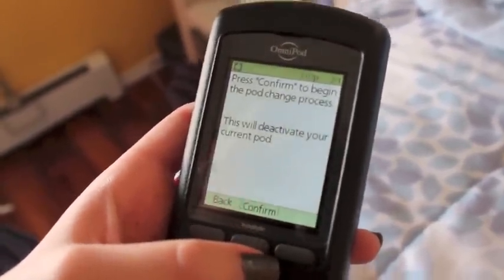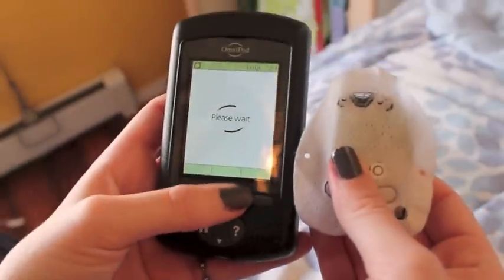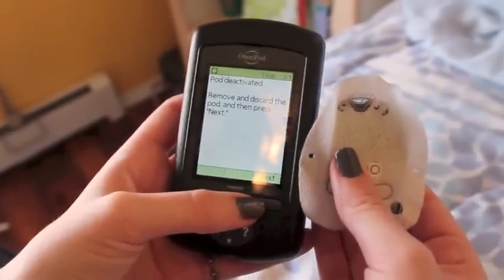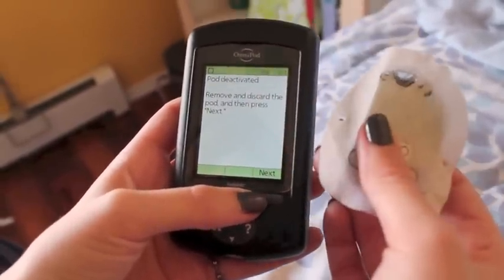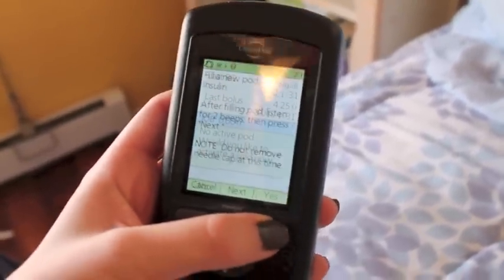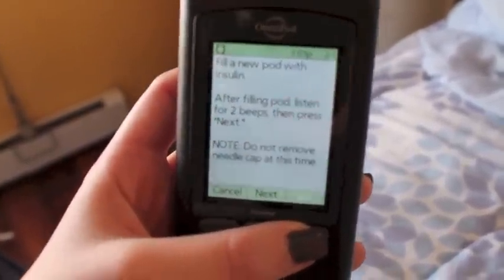And it says press confirm to begin the pod change process. This will deactivate your current pod. So you press confirm and it will beep to tell you it's deactivated. So it says now remove and discard the pod, which I've already done. And then press next. No active pod. Would you like to activate a pod now? You say yes, and it tells you to fill a new pod with insulin, listen for 2 beeps, and then press next. So we're gonna do that now.